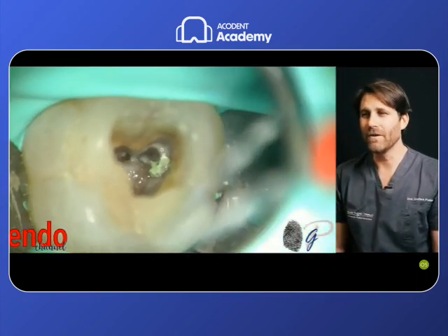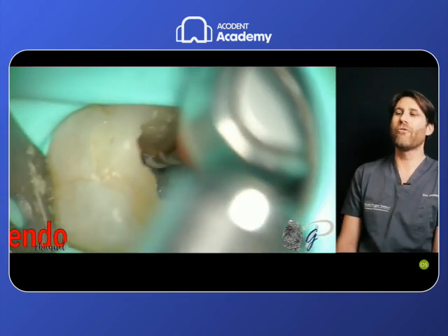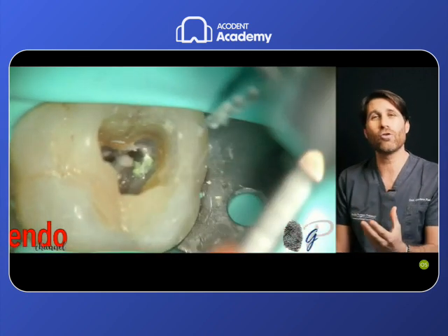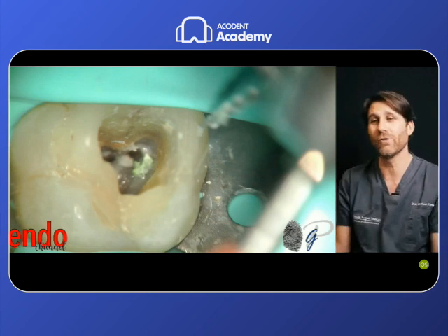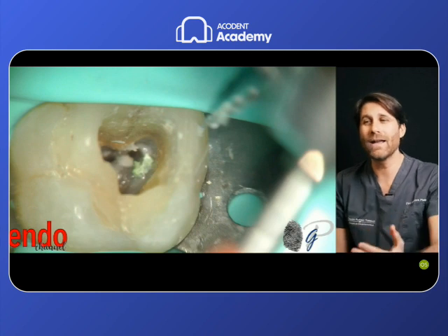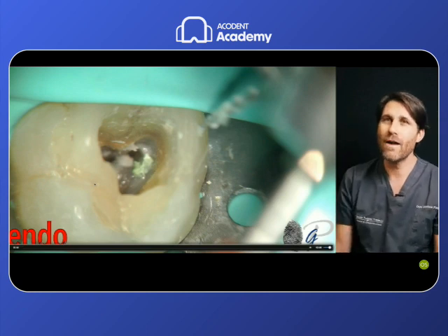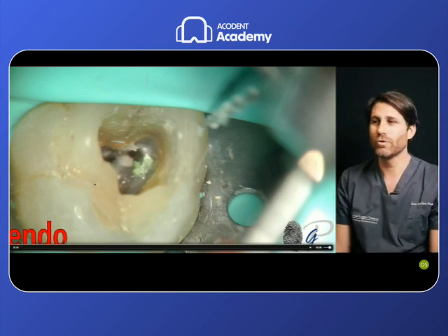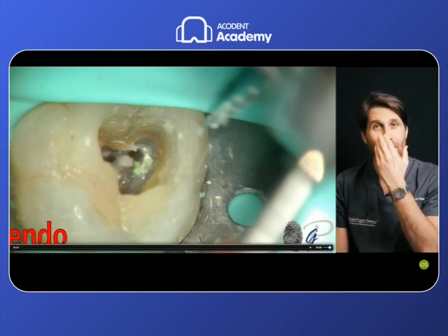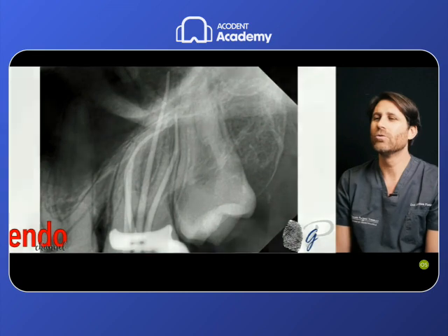Because of its cutting efficiency, it cuts dentin, penetrating inside the root canal. Because of its flexibility, it follows the path of least resistance of this MB2 root canal, and then after the removal of this coronal interference, after penetrating 4 or 5 millimeters of this root canal, you will see it's much easier to penetrate apically, because we have relocated the orifice, we have removed this interference, we have reduced this coronal curvature. In most cases, this MB2 root canal is confluent with the MB1, and so the apical third can then be easily scouted after this coronal root canal third preparation.